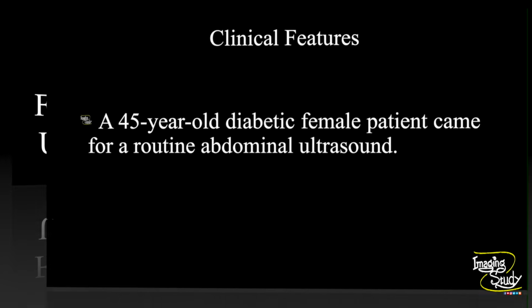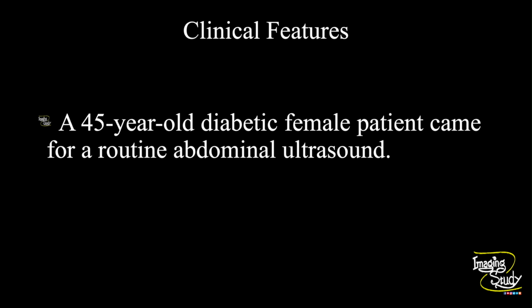Today we're going to see a case of fibroid uterus. A 45-year-old diabetic female patient came for a routine abdominal ultrasound scan. Let's see what we have got on ultrasound.